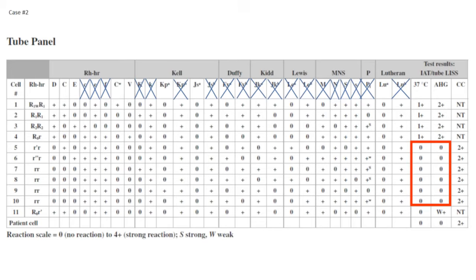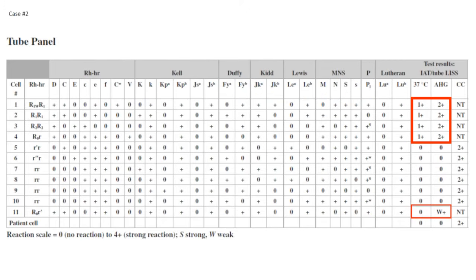But in the meantime, what were you able to identify in this case? We could identify an anti-D. Right. So the reactivity is corresponding with an anti-D, right? So what is the patient's ABO Rh blood type? A negative. So the patient, as we explained, was A negative. What antibodies did you identify? An alloantibody against the RhD antigen.